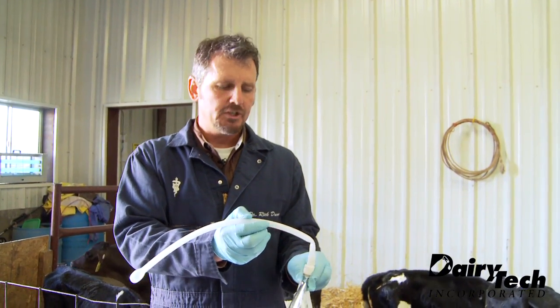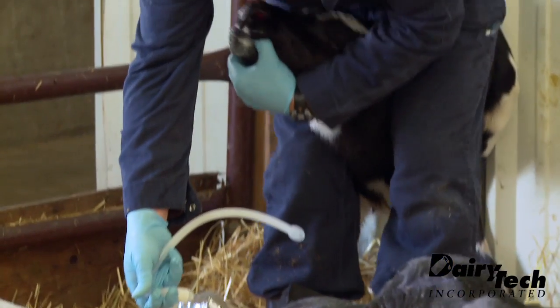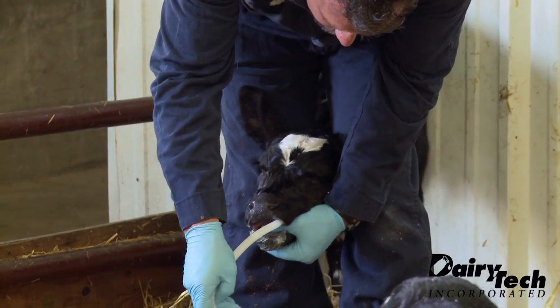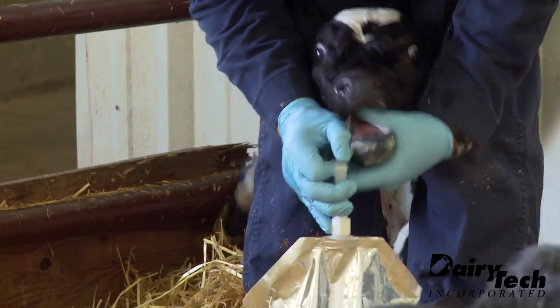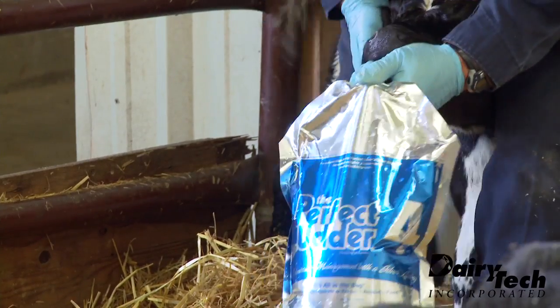Make sure it's in a good position, then I'll straighten the bag out to feed the calf. We'll kink that tube over, get the tube right down the side of the mouth and let the calf swallow it nice and slow. Then I can hold up everything in one hand.